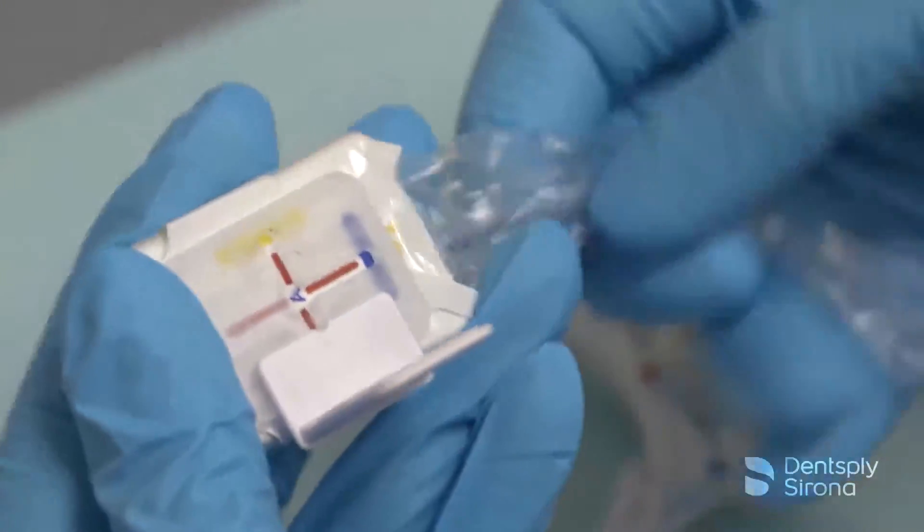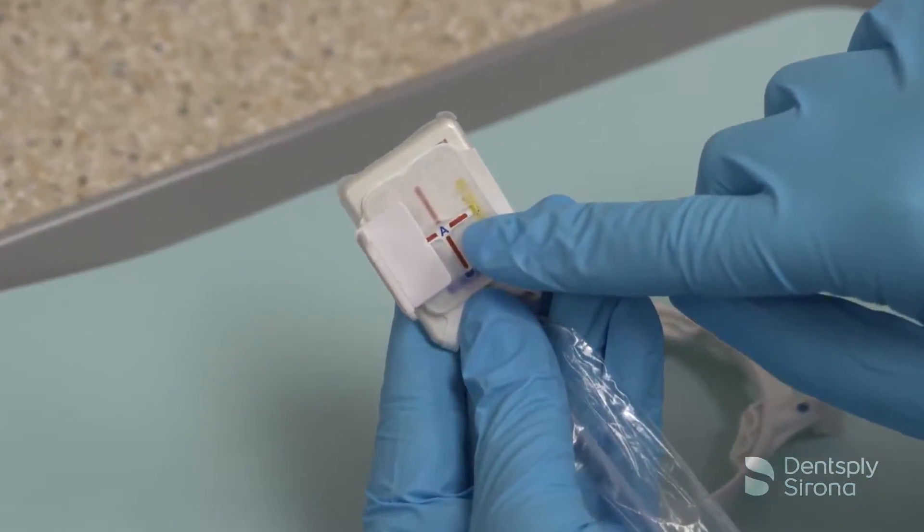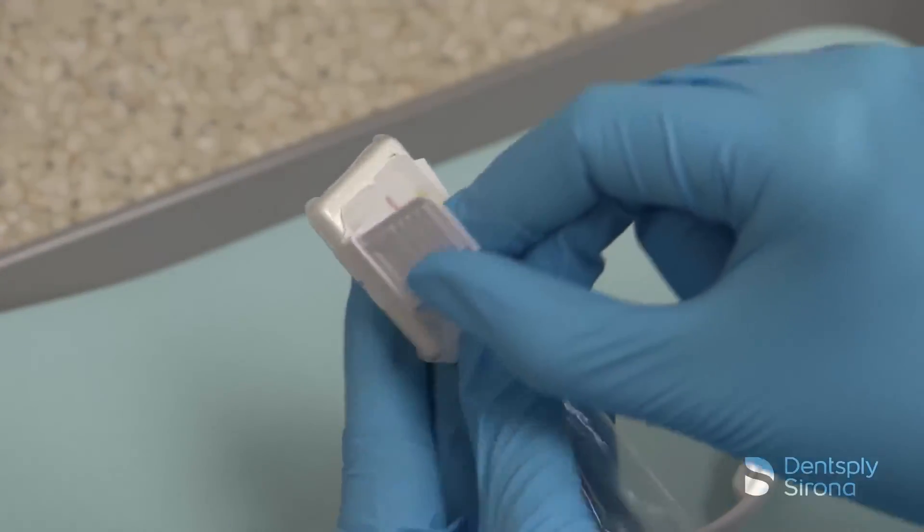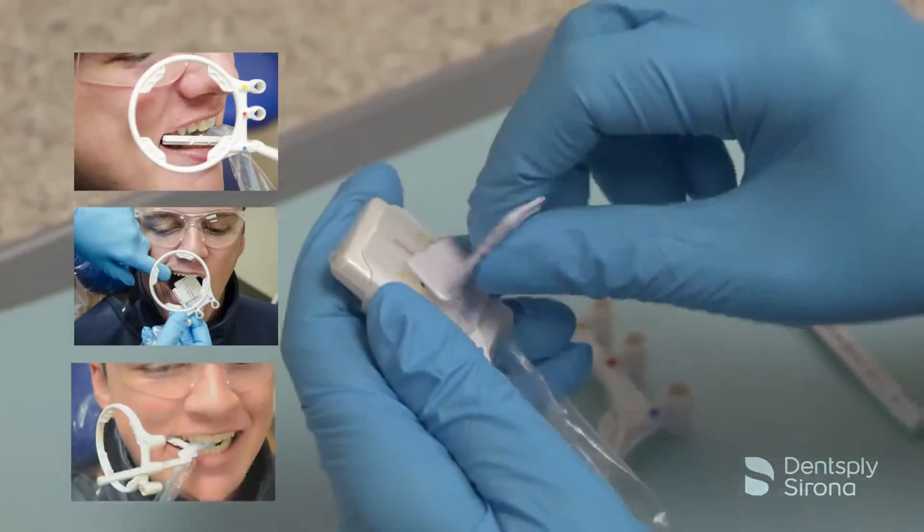This rotating tab allows clinicians to slide the bite piece along the channel, enabling them to take anterior, posterior, and bitewing x-rays.